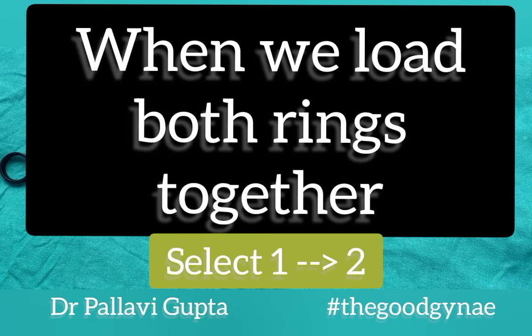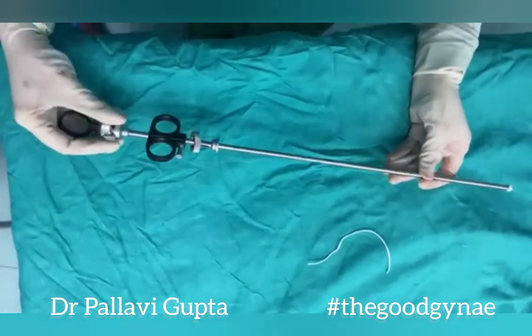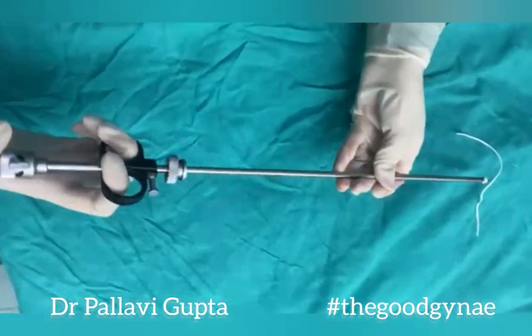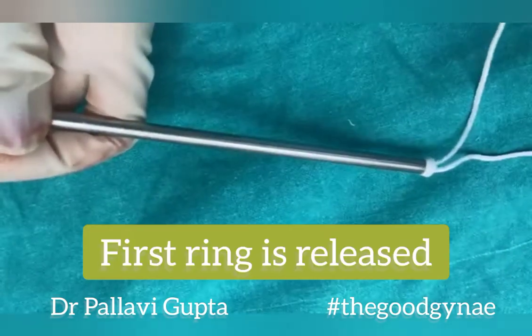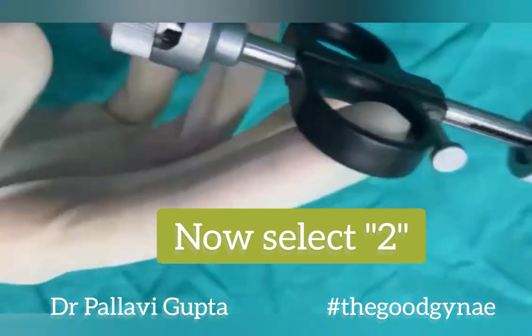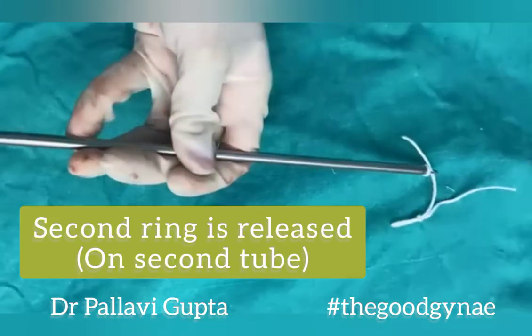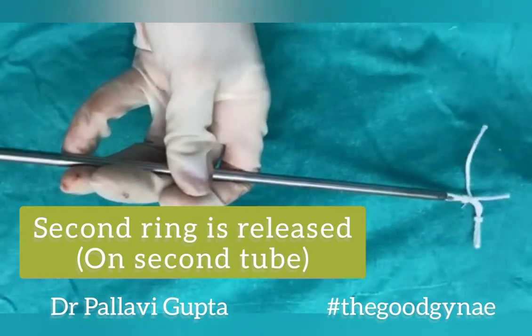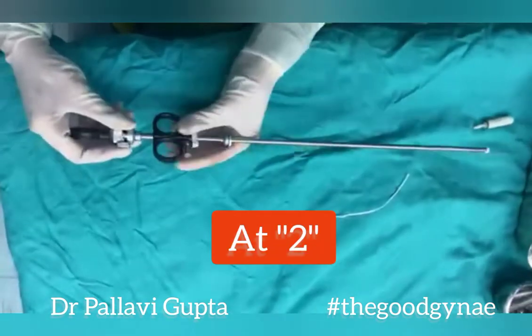When working with both rings loaded at the same time, the ring delivery collar is first put at 1. This pulls the inner sheath partially inside, and when we fire, only one ring is released over the fallopian tube. After this, we move the ring delivery collar to 2, which pulls the inner sheath in completely, releasing the second ring over the fallopian tube.